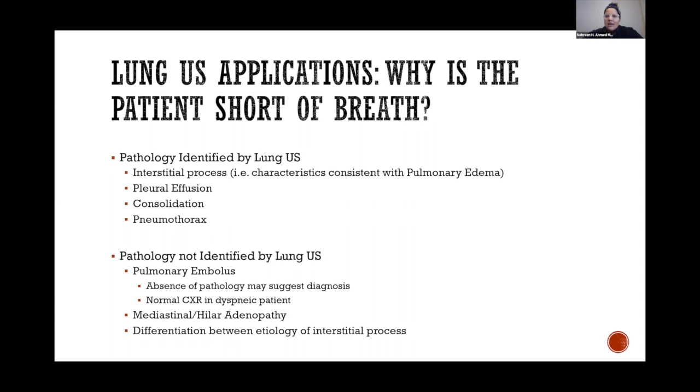So what are the main applications? In point-of-care ultrasound, you always want to ask a question, because that specific question is what you're trying to identify on the patient to help you understand what's wrong and what the pathology is. With lung ultrasound, usually the question is, why is the patient short of breath? So what are some of the pathologies that lung ultrasound can identify to help you answer that question?